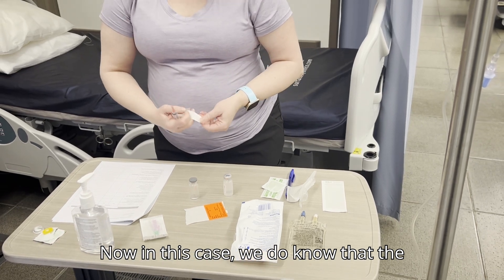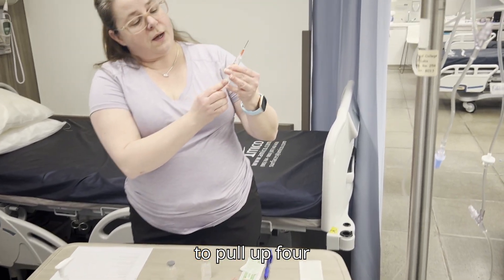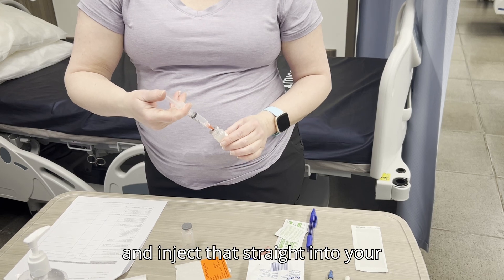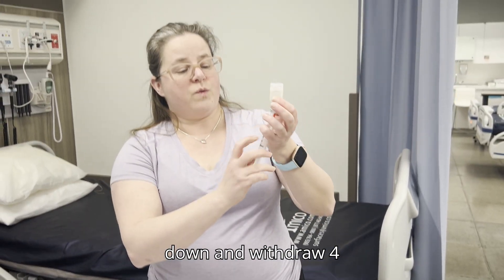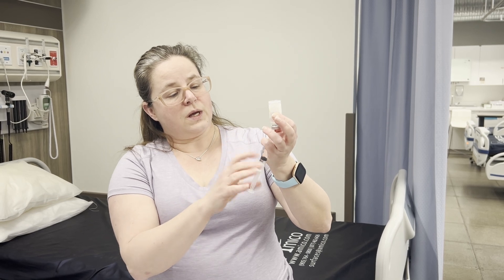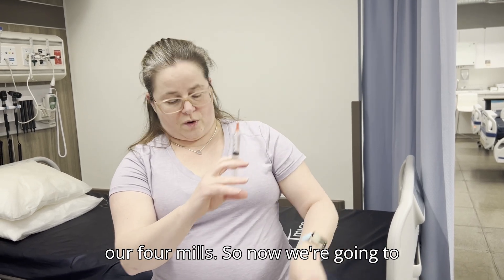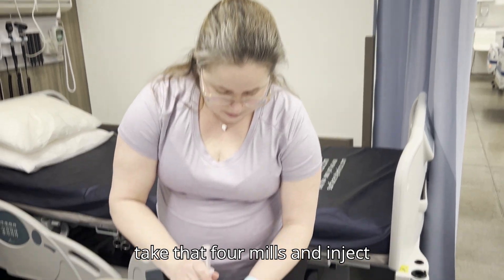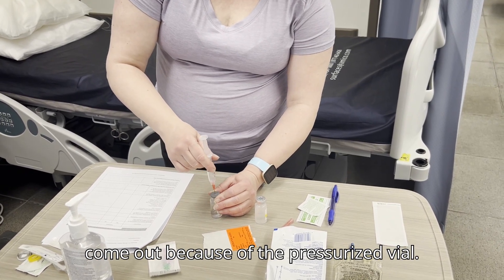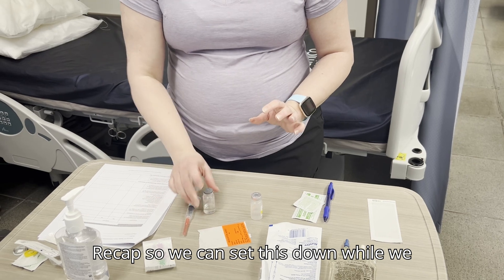We need to reconstitute this with 4 mils, so we pull up 4 mils of air on the syringe and inject that straight into the saline vial. Then flip it upside down and withdraw 4 mils. Sometimes you get small bubbles — that's fine as long as there are no large bubbles. Now we take that 4 mils and inject it into our vial of medication. Some air will automatically come out because of the pressurized vial.